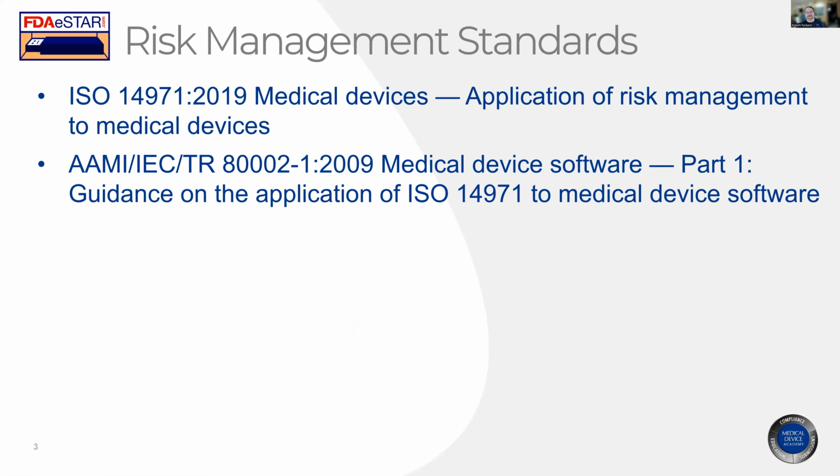Integrated with the software design and development process is risk management. Everybody out there that does software for the first time tries to apply ISO 14971. Yes, that is the standard for risk management in medical devices. But for software as a medical device, it's almost useless, because when you ask what kind of harm you're going to cause, they say, well, software can't hurt anybody, it's just software. No. There are all kinds of risks.